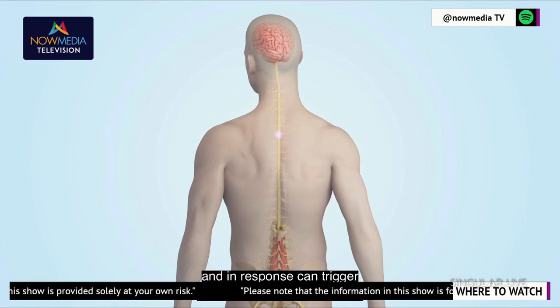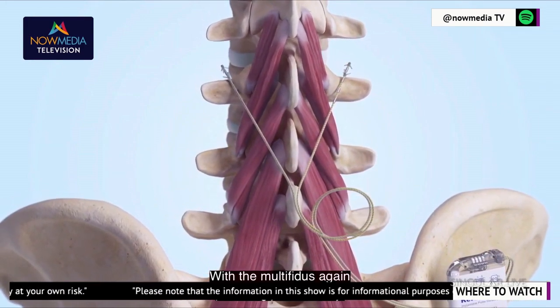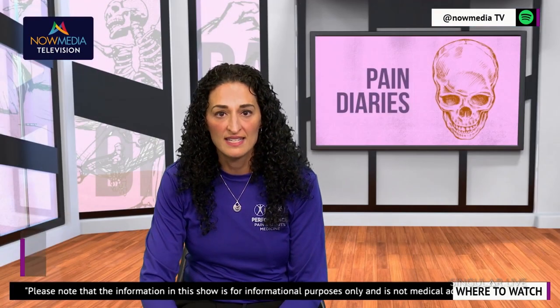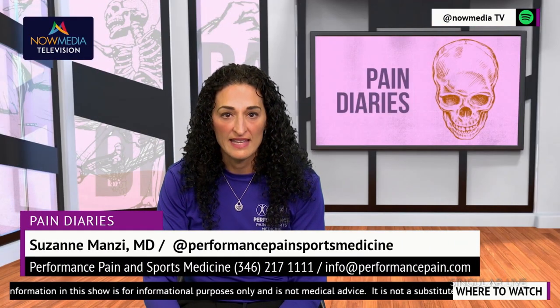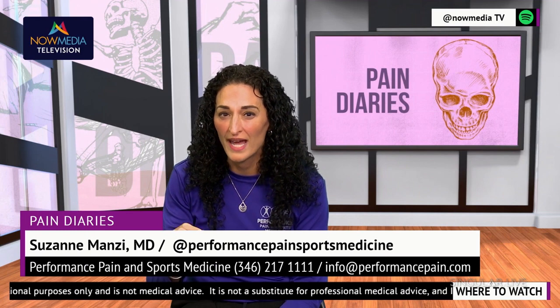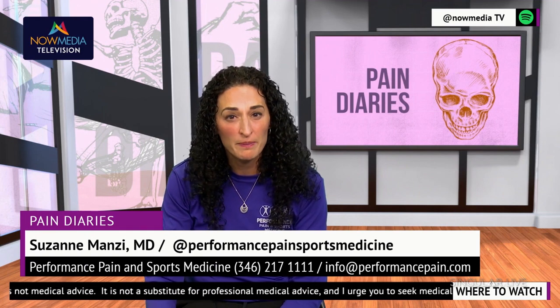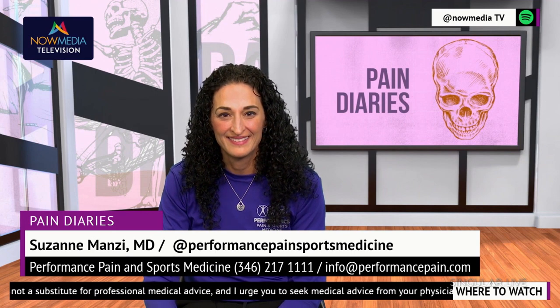Another question, will the patient be able to see or feel their implant? Well, patients will typically be able to feel where the IPG or battery is located with their hands. After 60 to 90 days, the body will heal around this site to the point where it's less perceptible to the patient, and they may be able to see the location of the incision but won't actually be able to feel it. You might be able to outline it through their skin when standing naturally or under clothing.